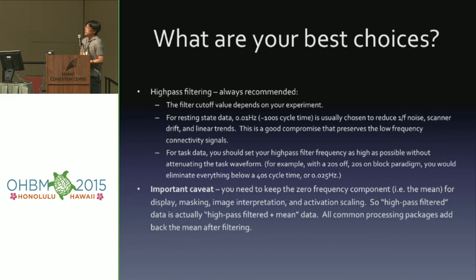Another important caveat here is that when you do high-pass filtering, it doesn't mean you remove the zero frequency component, because all the BOLD signal needs to be properly scaled to be displayed correctly. You can think of it as high-pass filtering all the data, then adding the mean value back, for the purpose of display and further interpretation. That's just for some people who might find this useful.